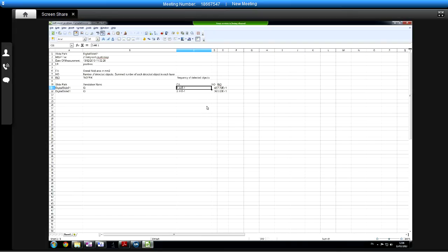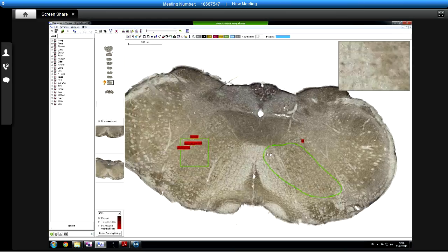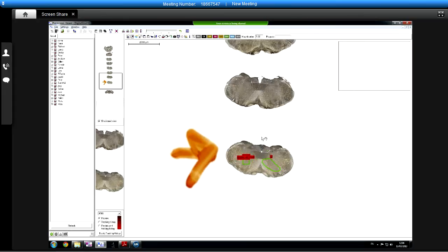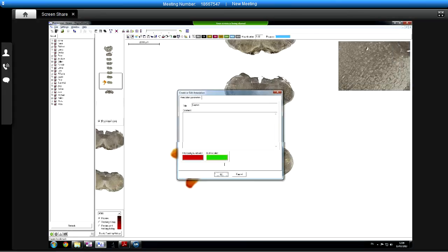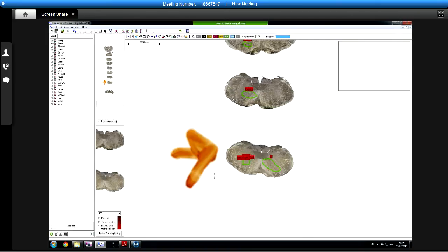Okay, so the final stage is, let's say we've tweaked it on a number of different slides, and now we want to mark up a bunch of different slides, or a bunch of different annotations on different slides. So let's just simulate that now, and then we can get rid of it again so it's not there. So let's say, for instance, we've marked some areas on different ones here, and then did we have a second slide from you? Not here. No. Okay. Well, so we've marked some areas there.